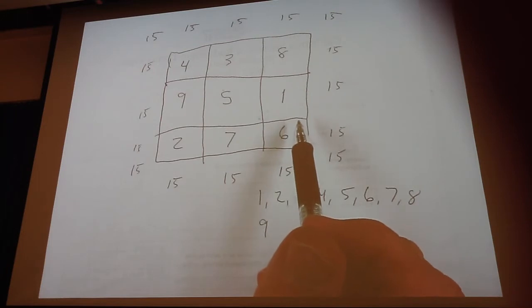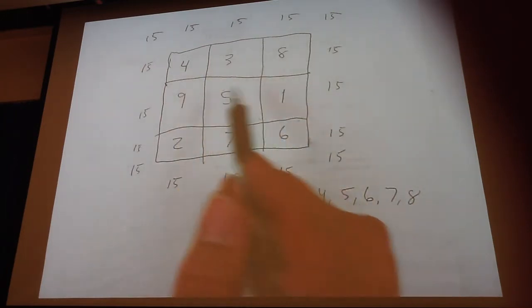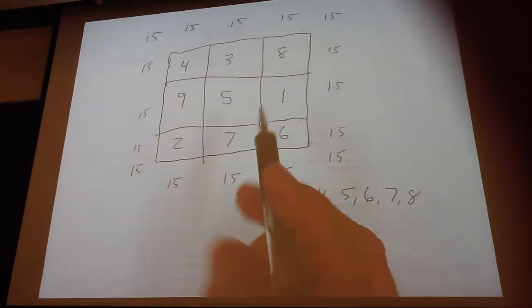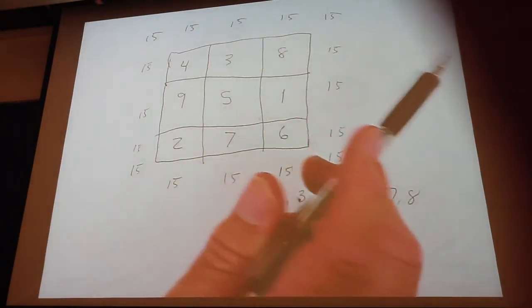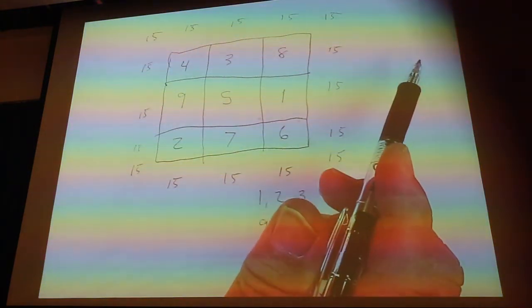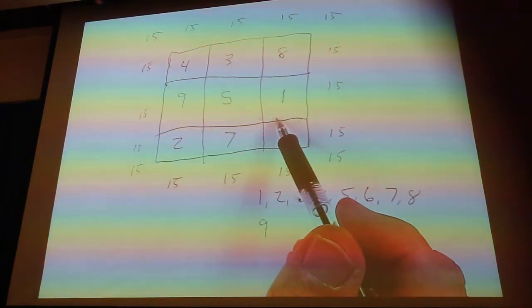That's why you tell the computer how many iterations you want it to attempt before you give up on it. If I would have given you this without the number 5 in the middle, it probably would have taken you some time. If I said, we're not going home until this iterative box is taken care of. So now you understand the difference between iteration and back projection?